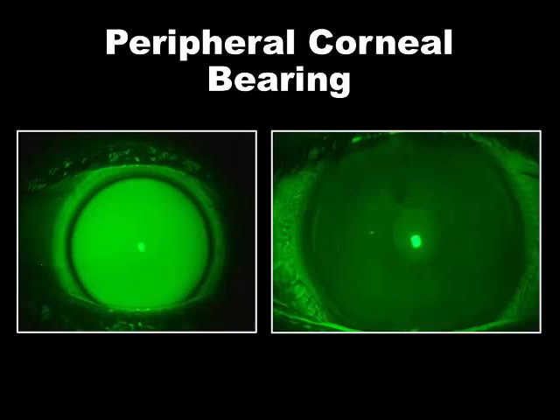So we would order from the lab limbal clearance zone +5, maybe even +7 or more, to vault through this area. If we cannot clear this peripheral corneal elevation, then we would go up to the ICD 16.5 to make sure that we can vault that area.